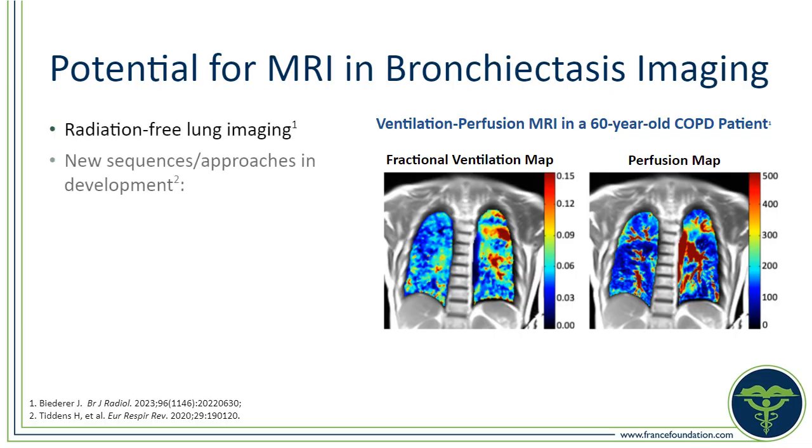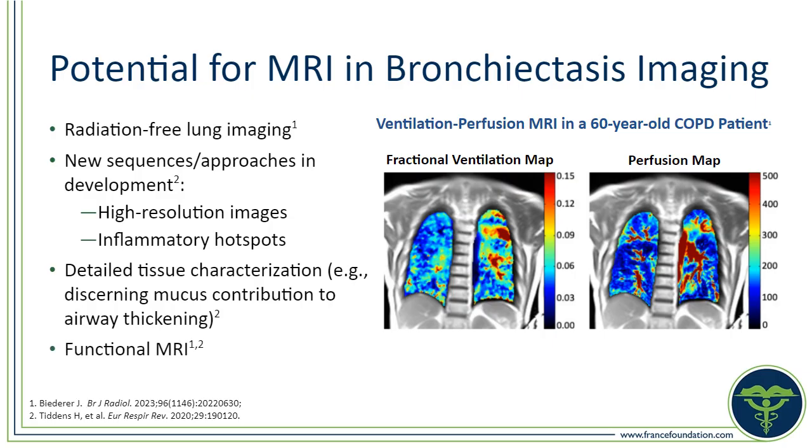Functional MRI also is very exciting to see what happens in the lungs as the patient breathes in and out. With MRI, we're not limited by radiation dose, so we can get more functional data, which helps the pulmonologist make important decisions about treatment.